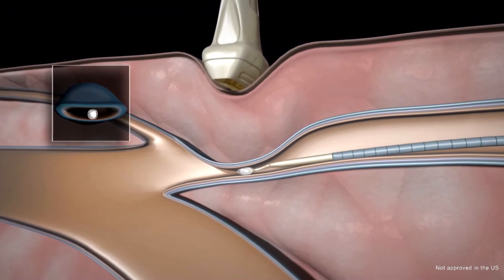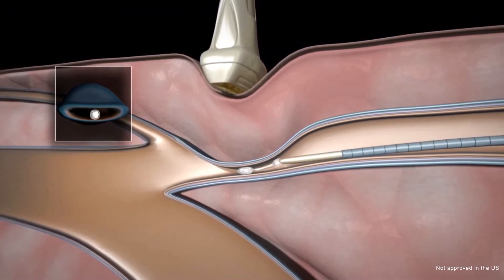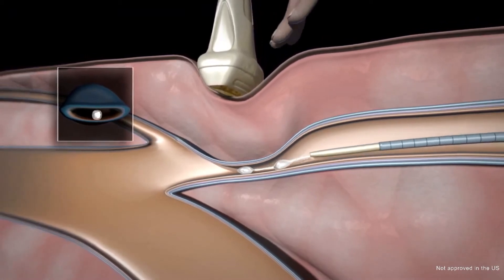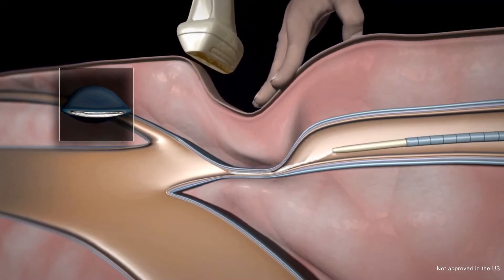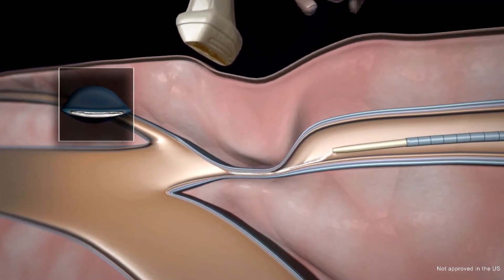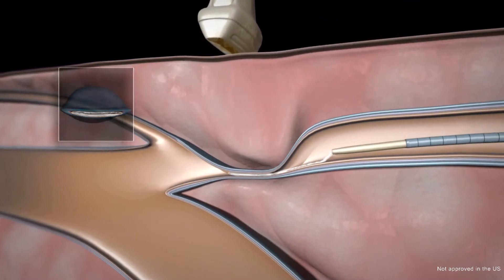The catheter is pulled back one centimetre. A second injection is made and the catheter is pulled back three centimetres. Gentle compression is also applied with the practitioner's free hand near the ultrasound transducer.